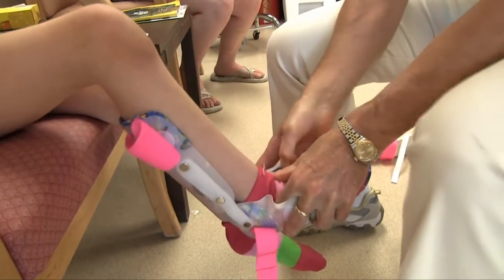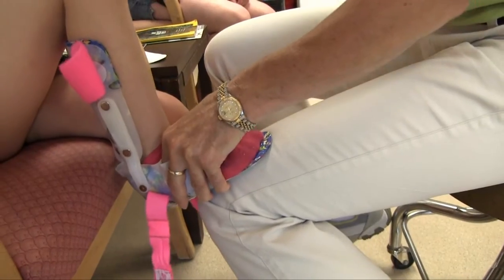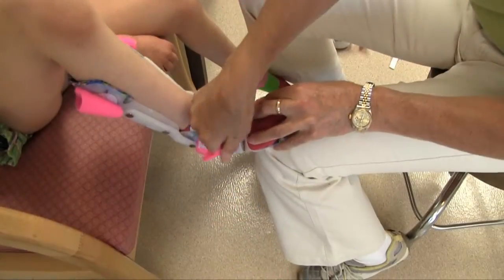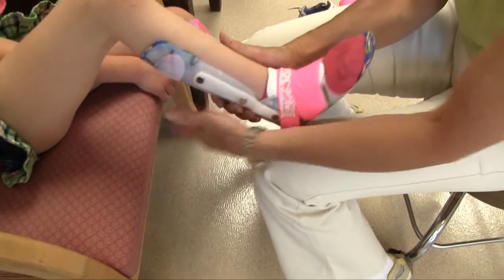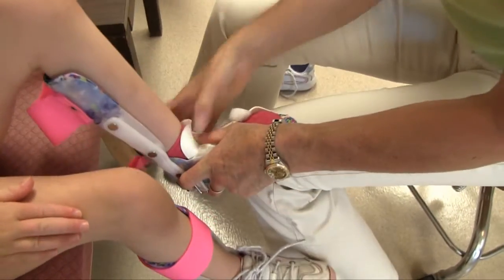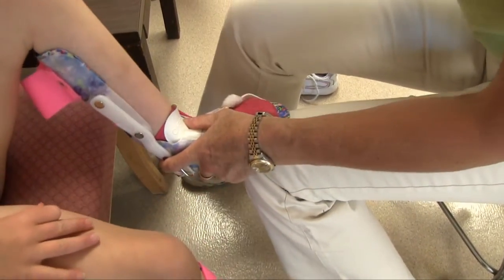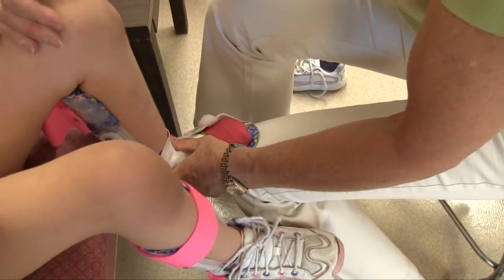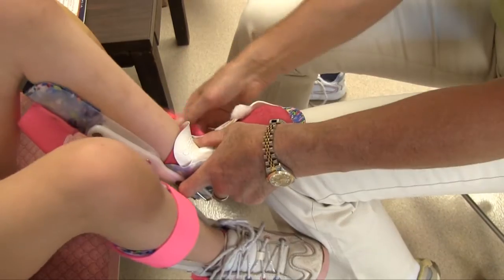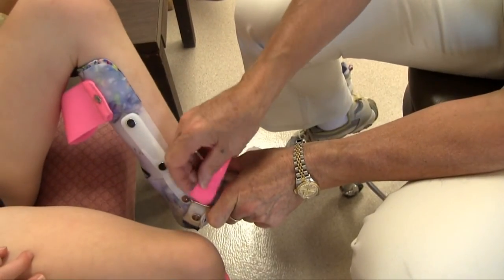Summer has been fit now with a DAFO 2 plantarflexion block to prevent the excessive toe walking. We have incorporated a heel control pad to prevent that foot from also elevating in her brace. That left side is challenging to seat in the back of the orthosis because of the excessive extensor tone, and it takes quite a bit of effort to make sure that she is well seated, and we want to make sure that her heel is down when the orthosis is tightened up.